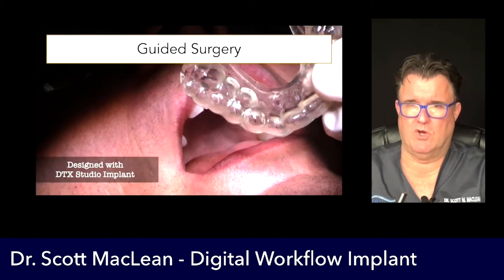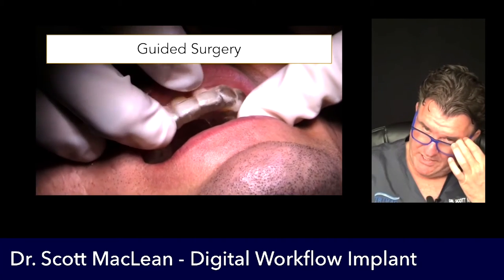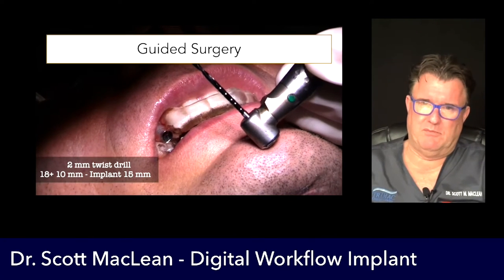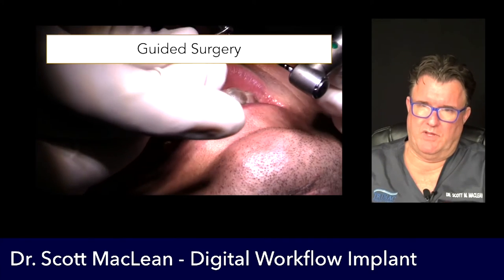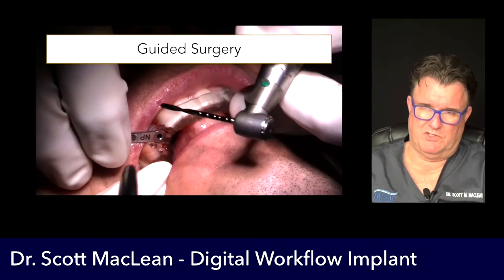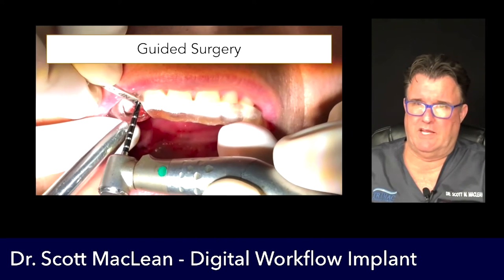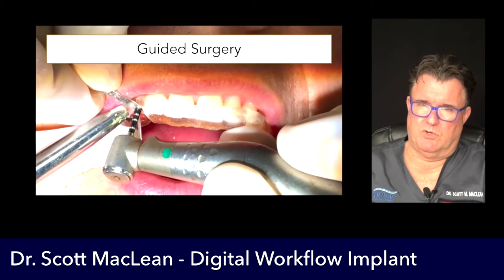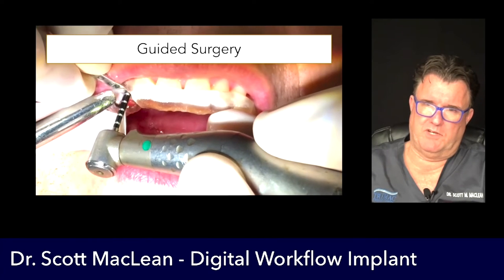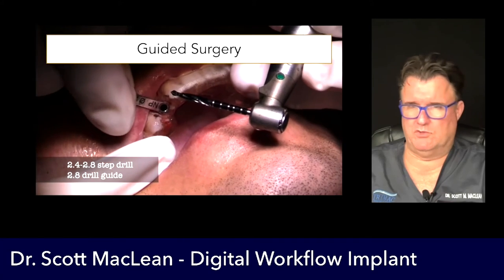When you take the template to the mouth and put it into position, it controls how deep the implant is, what angle, and what position. It keeps the implant away from teeth, sinuses, and nerves, and gives you confidence in where the implant is going to go. This patient had an extraction and now we're placing the implant. We go in with a 2mm twist drill — the template guide allows us to fit into the template at the exact position. These drills are about 10 millimeters longer because of the guide sleeve.